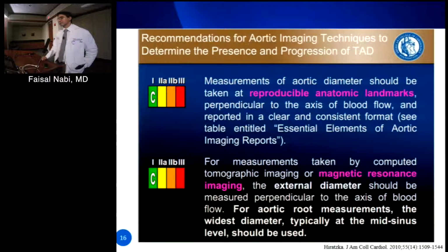What did the new ASC aortic guidelines say? I think it's the chamber dimension guidelines, right? No, there's aortic guidelines in 2015. They actually have a nice paragraph in there saying the committee hopes to try to resolve these differences, but was unable to, and therefore recommends echo continue doing the way it does and MRI continue to do the way it does. But do you understand? You're not going to be able to resolve it.